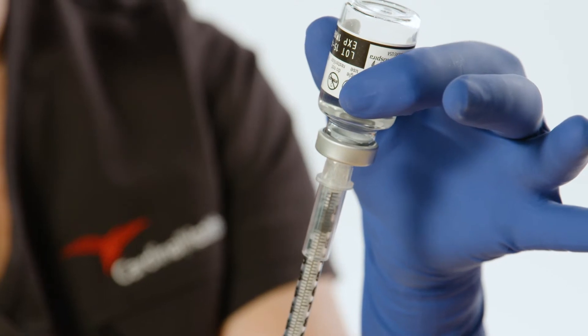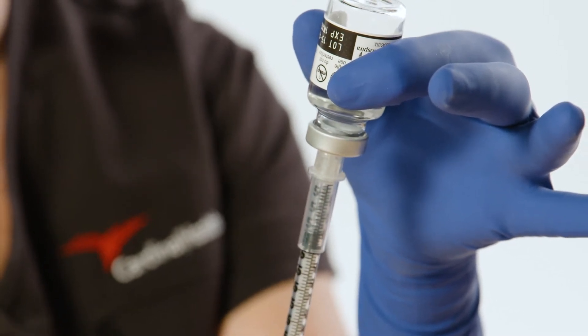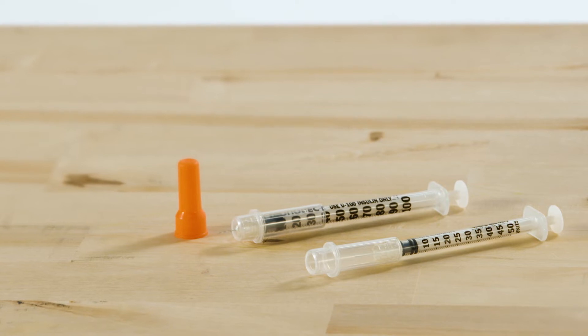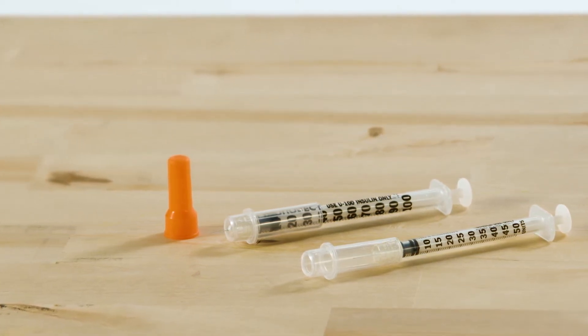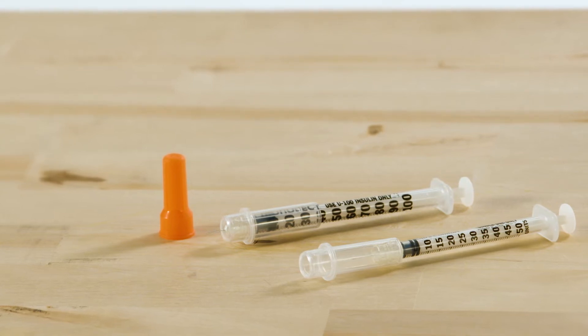Draw medication from vial according to your facility's protocol. Monoject safety syringes have a permanently affixed safety shield that cannot be easily removed and eliminates the need to recap the needle.